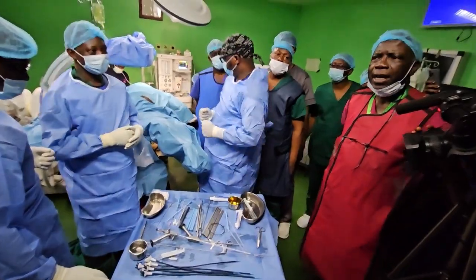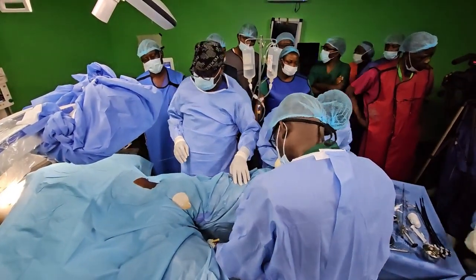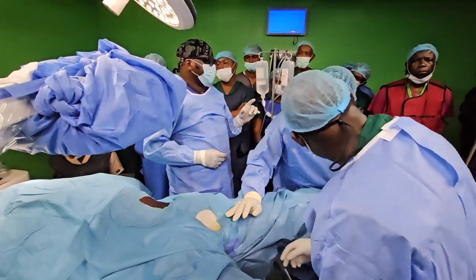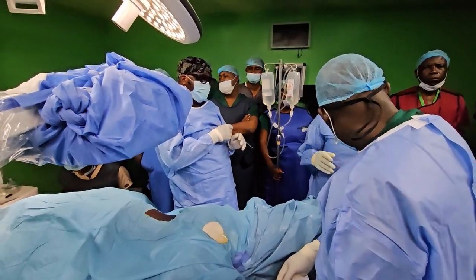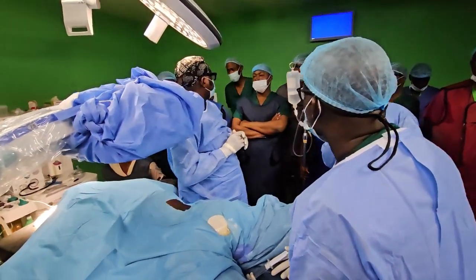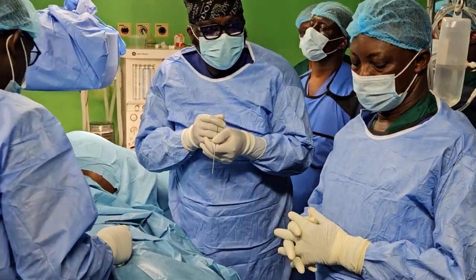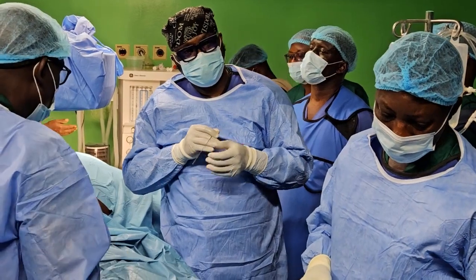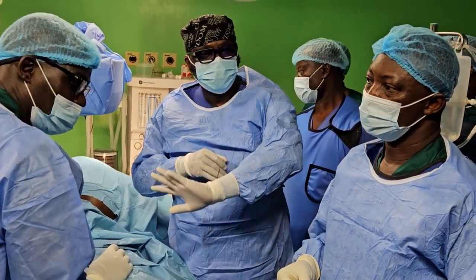A quick additional point, a basic point, for your initial puncture. Let's assume you get into the system and you didn't know, you withdraw, and you make another puncture. If you load contrast, you will feel it from below, it will extravasate. If you mistakenly enter the system without knowing and you withdraw your cannula, you have created a point of leakage of contrast. So the contrast will extravasate and blur your pelvicalyceal system.